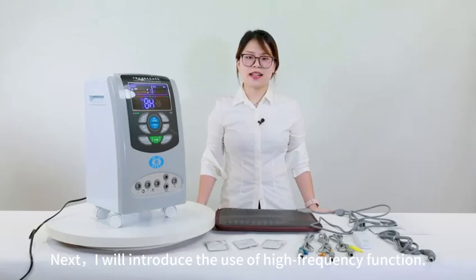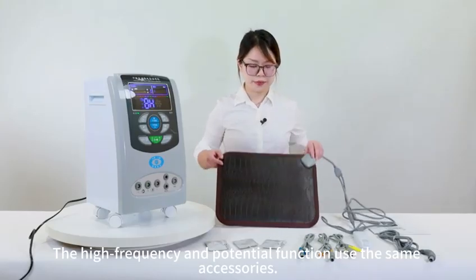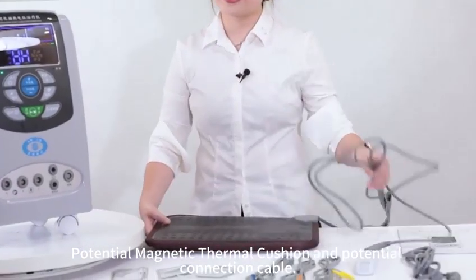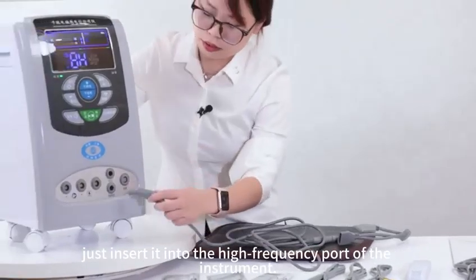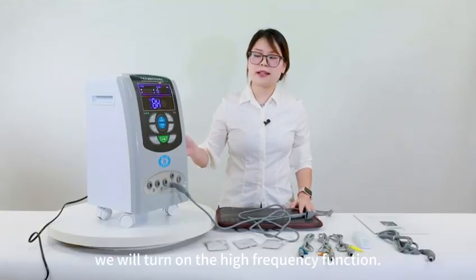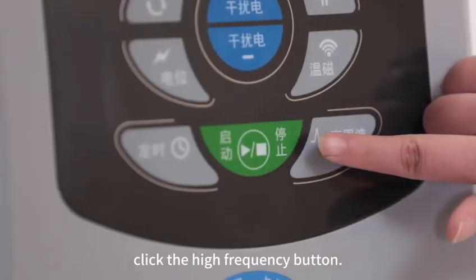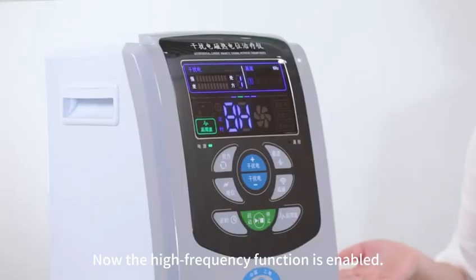Next, I will introduce the use of the high-frequency function. The high-frequency and potential functions use the same accessories: the potential magnetic thermal cushion and the potential connection cable. Just insert it into the high-frequency port of the instrument. Okay, next, we will turn on the high-frequency function. Then, on our control panel, click the high-frequency button. Now the high-frequency function is enabled.